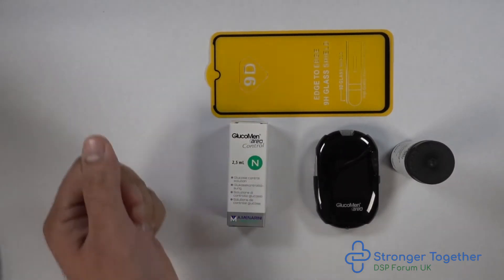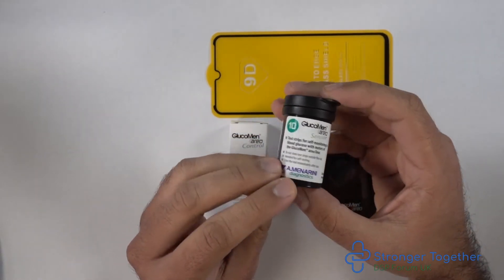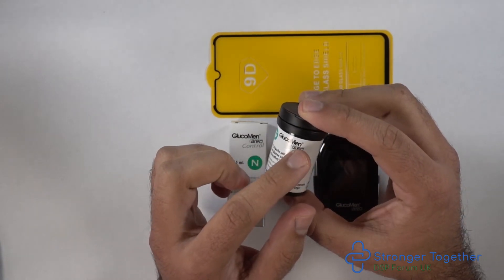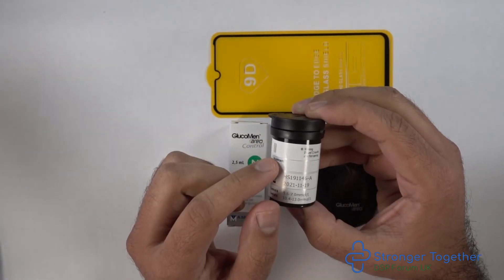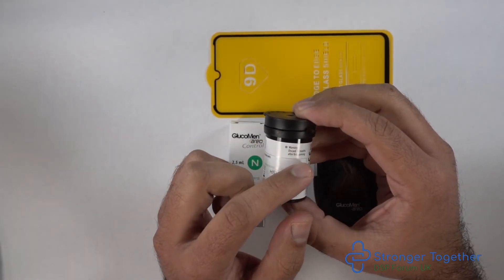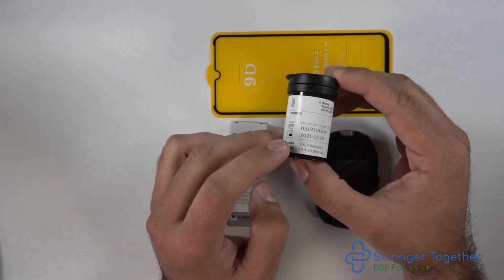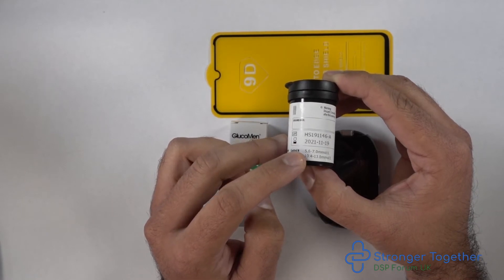Our control solution is marked with the letter N for November in a green circle. If we take our test strips — make sure they are for our Aereo machine — once you open them, write the date on the pot. If we look at the bottom, it says control N and control H. In this instance our control solution is N, so we should get a reading between 5.6 and 7 millimoles per liter.